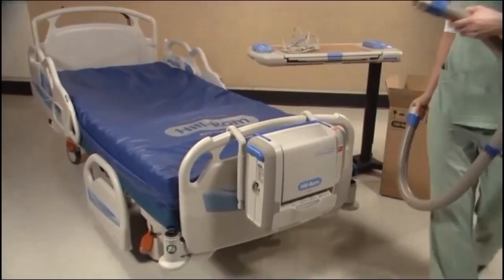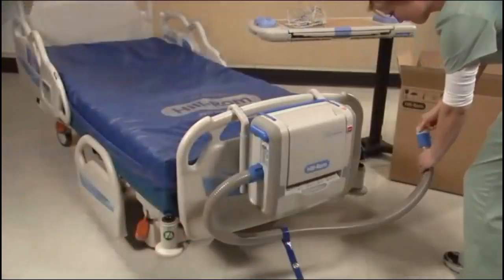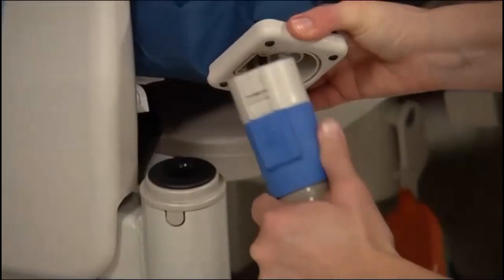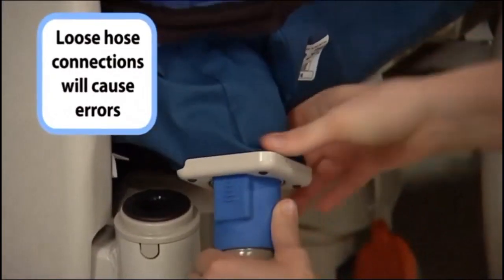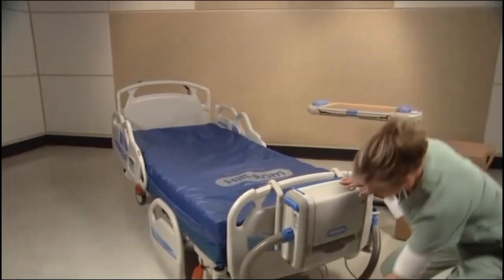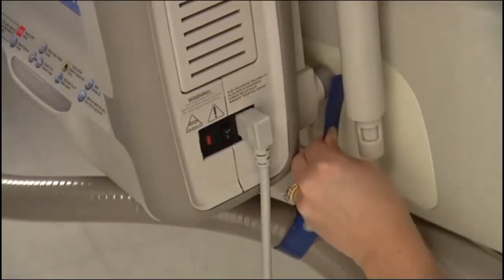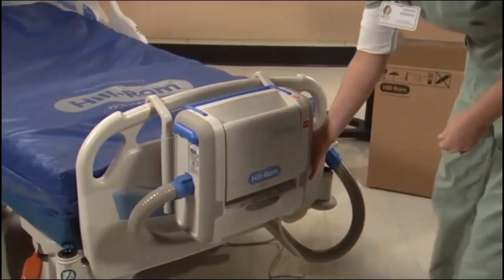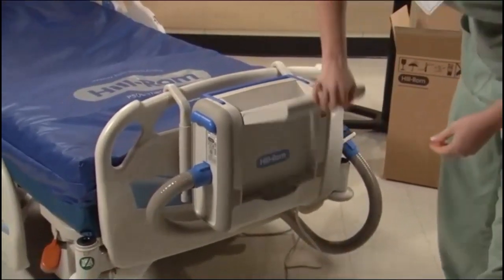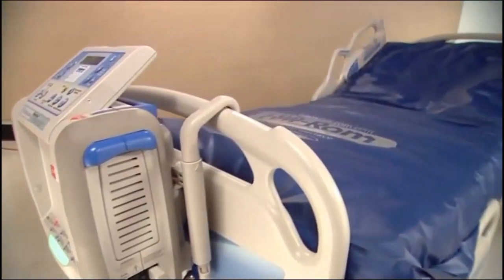Next, connect the air hose to the surface and to the air control box. The ends are interchangeable, and you can hear a click when it locks firmly into place. Loose hose connections will cause errors. Use the hose support strap to support the hose to keep it from slipping to the floor. Simply wrap the strap around the hose and connect it to the hook on the bottom of the air control box. Finally, connect the power cord and position it out of the way to prevent any accidents.